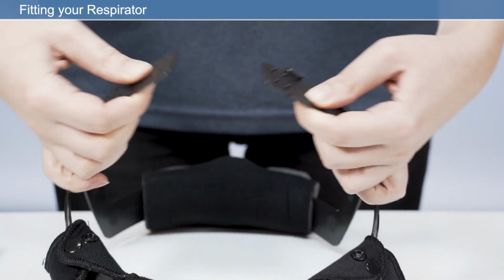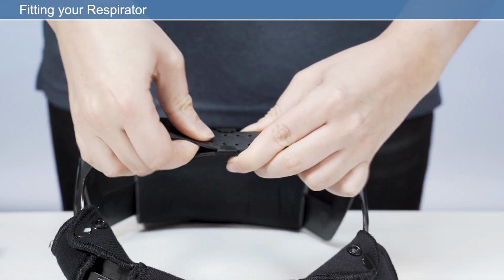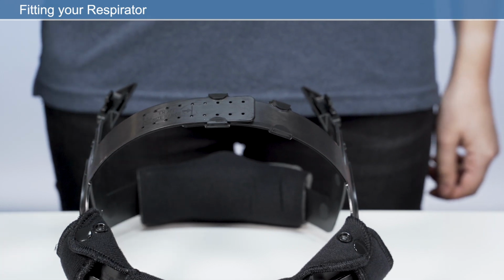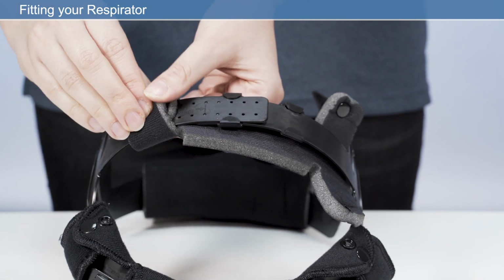Adjust the length of the strap as required. This position will ensure correct head ventilation for the product. If fitted correctly, the headband should fit securely on the brow above the eye line. After adjustment, reposition the crown pad on the headband strap.